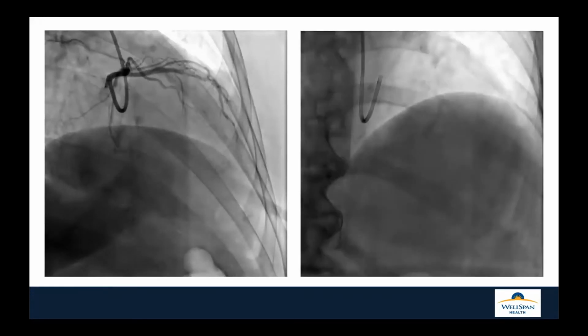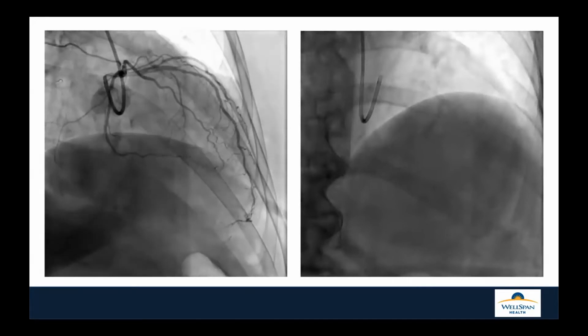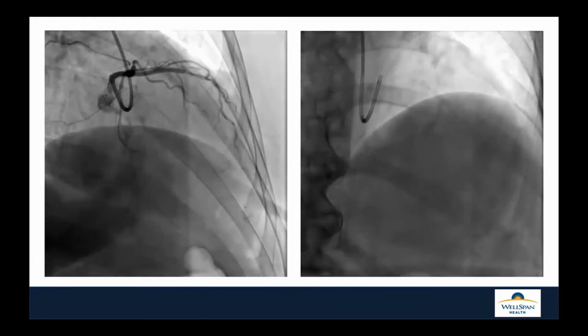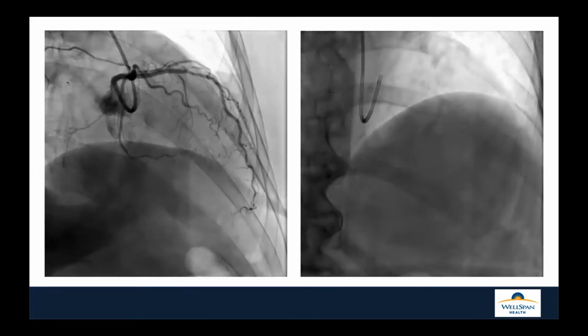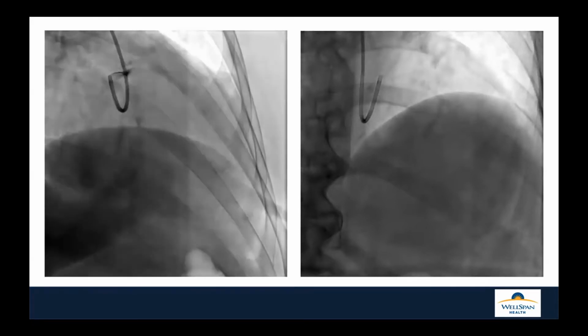And if you look here, you can see what I had actually called. I didn't take these angiograms, but I thought that was fairly, especially with that long of an LAD, an indeterminate lesion that angiographically looks more moderate. But with that long of an LAD, we thought would require a little further intervention or at least assessment. Next slide.